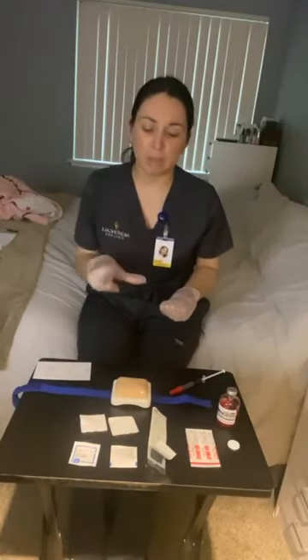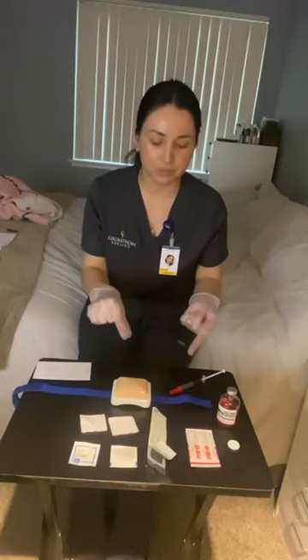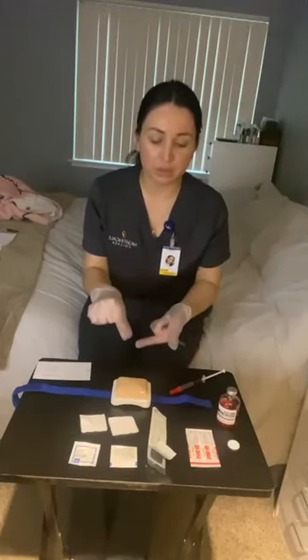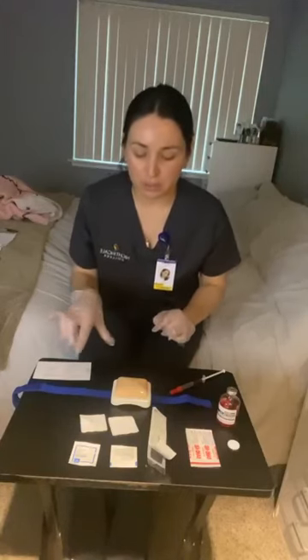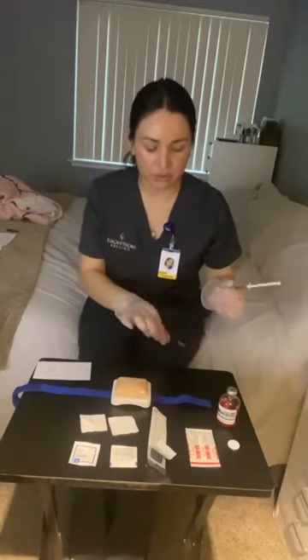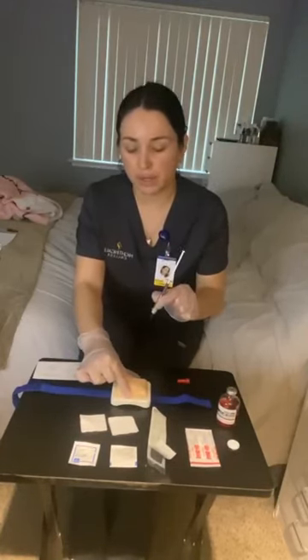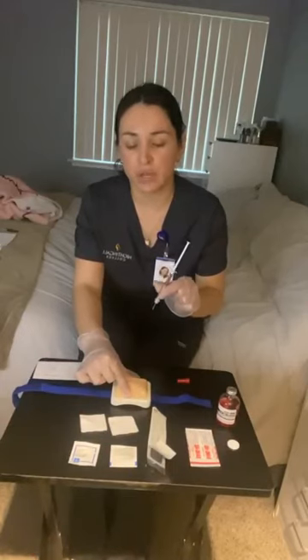I'm going to make sure I pinch the skin and, from top to bottom, the needle should be half that size. Next, for an average size adult, I'm going to grab my needle now. I do want to pinch the skin for an average size adult. I'm going to inject the needle quickly and firmly, and it should be at a 45 to 90 degree angle.